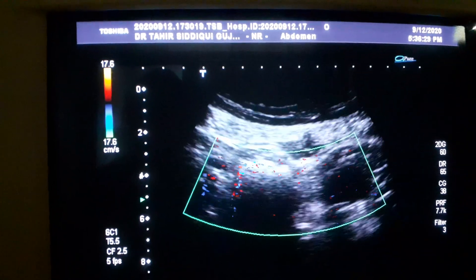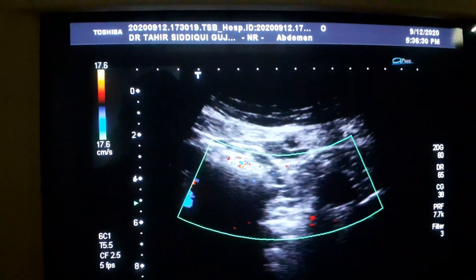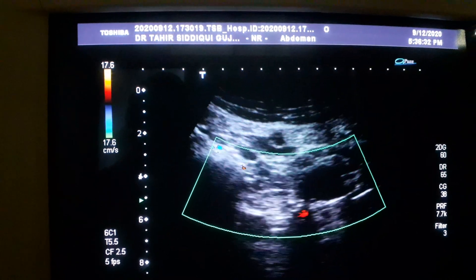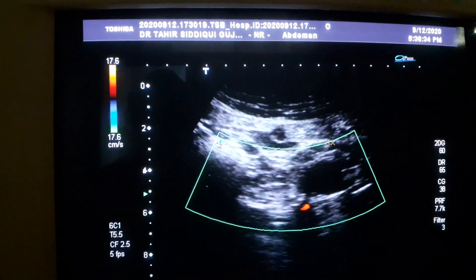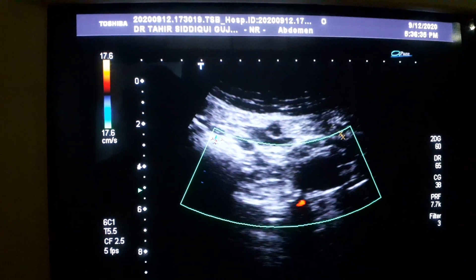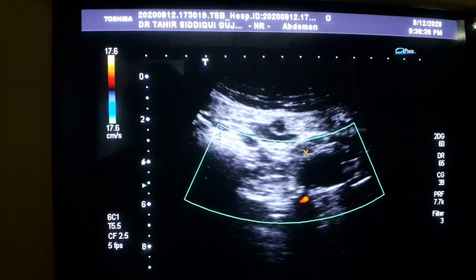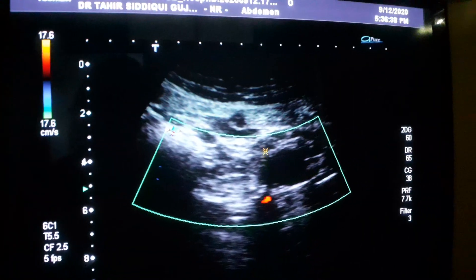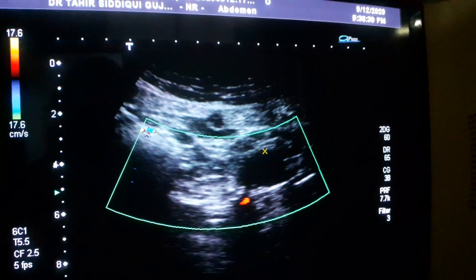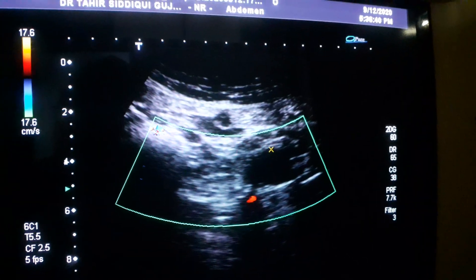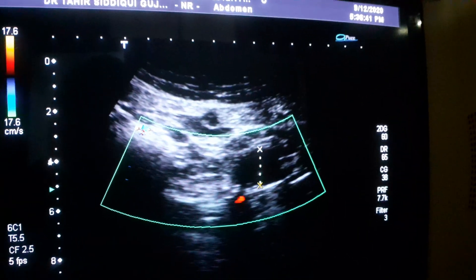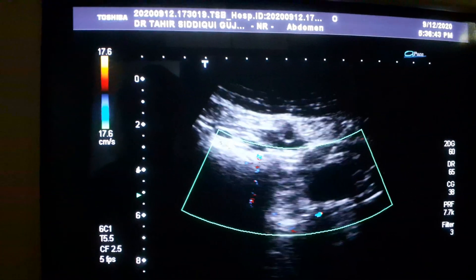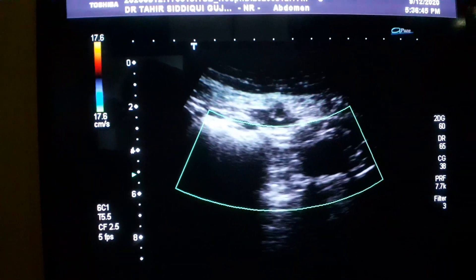Here is the left ovary. You can see the dominant follicle within it — follicle activity is seen. This is the left ovary, and this is the dominant follicle. It measures 16.5 millimeters.